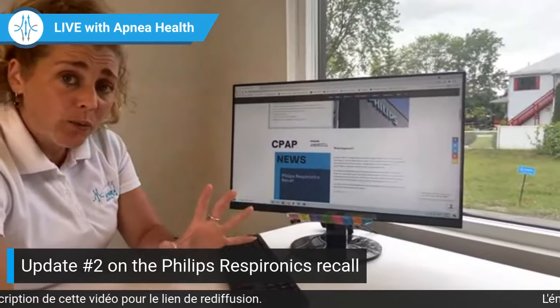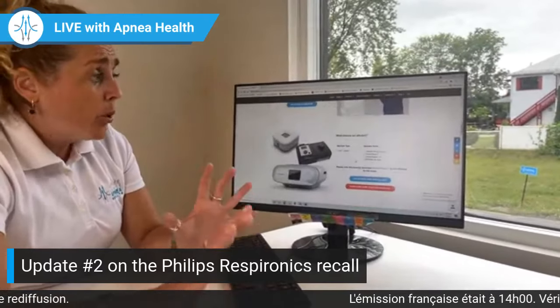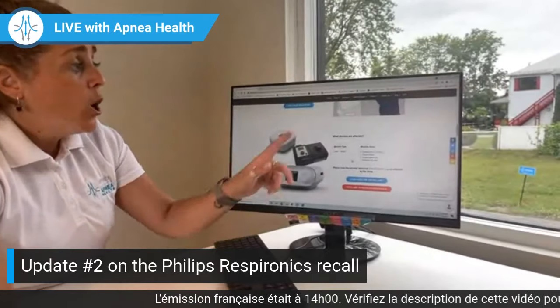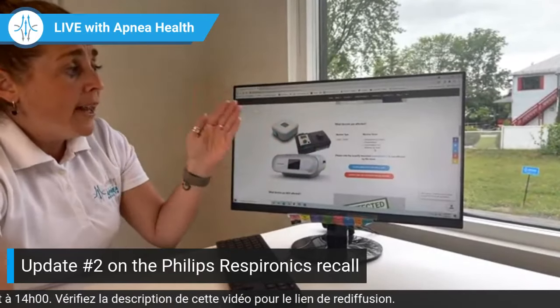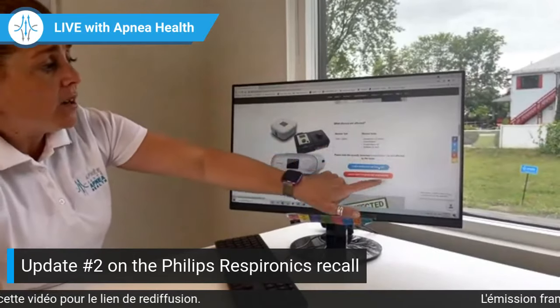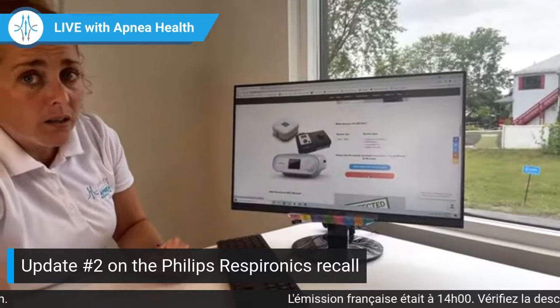So I told you what happened. I need to let you know really important information before we continue. First things first, the devices that are affected: System 1, DreamStation, DreamStation Go, and RemStar. If you want the full list, you can just click here, and you can click here to register your device if it's part of the recall.